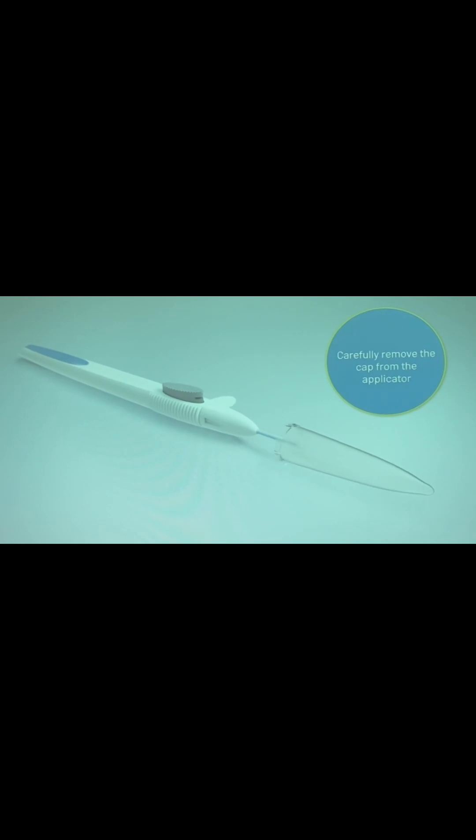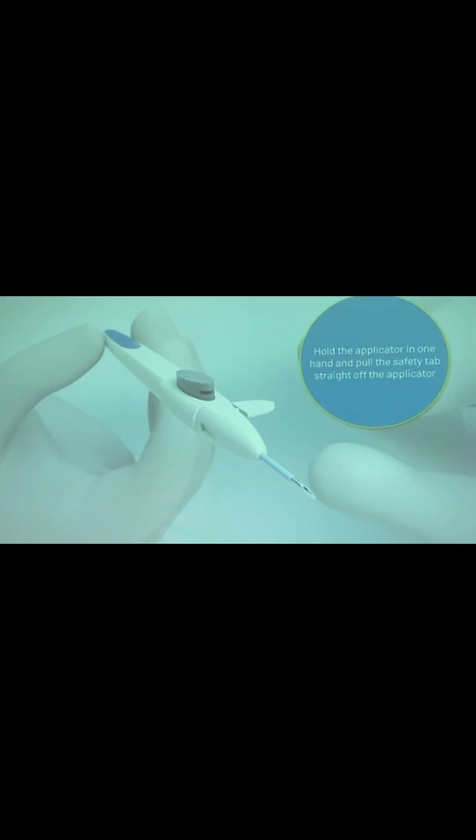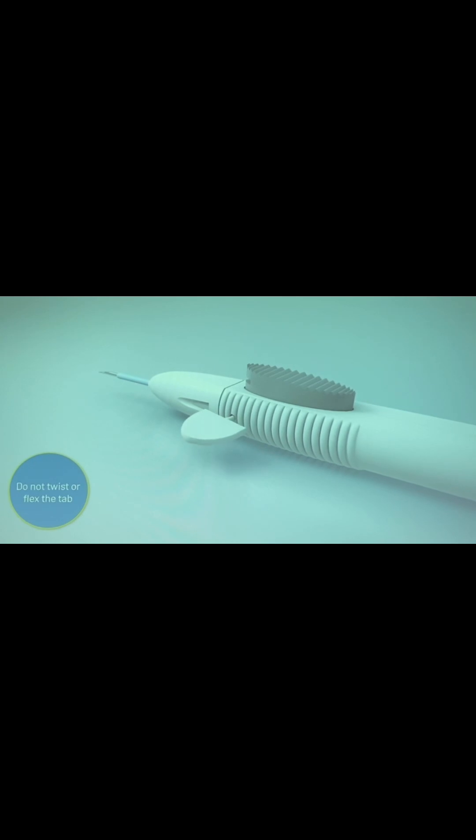Carefully remove the cap from the applicator. Hold the applicator in one hand and pull the safety tab straight off the applicator. Do not twist or flex the tab.